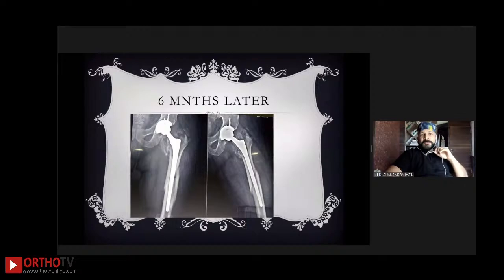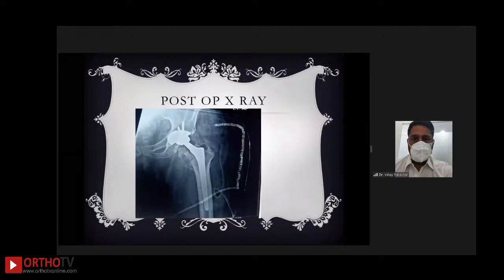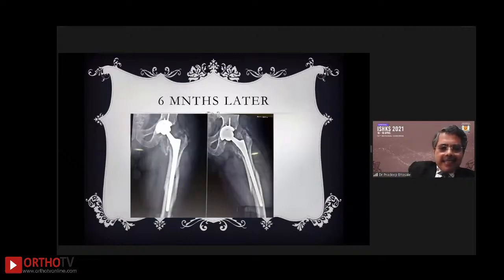So at this stage, what are the options which we have? Dr. Patil, can you go back one slide and show us the post-op x-ray? Basically this has happened post-trauma, but there was already a stress riser, the hole. The standard rule everybody should follow is to bypass the stress riser, with at least 2 cortical diameters distal to it. So this has occurred post-traumatically.